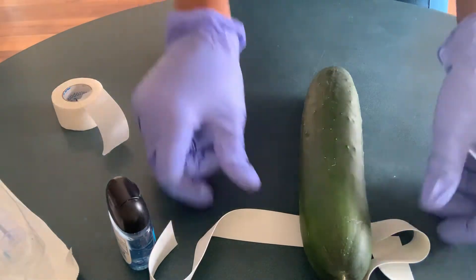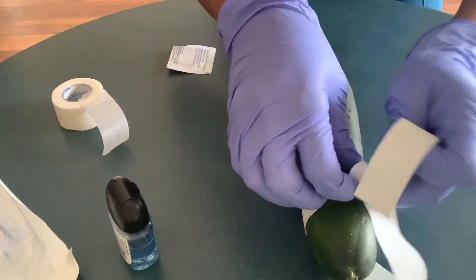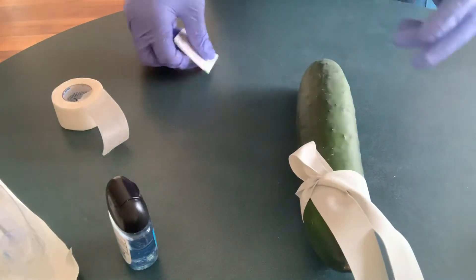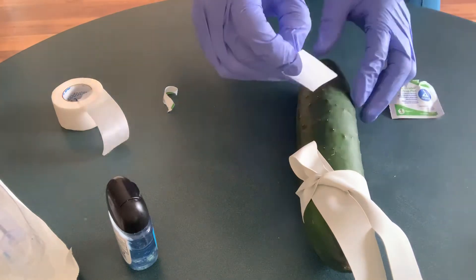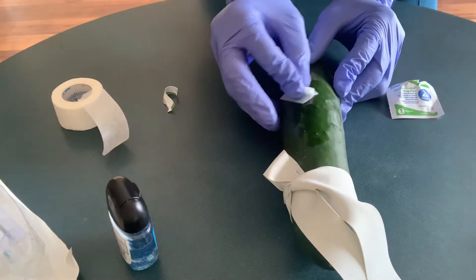So I'm going to put back the tourniquet. Then since I've already marked the site where I'm going to use, I'll use my alcohol wipes to wipe the area — wiping from inside out.